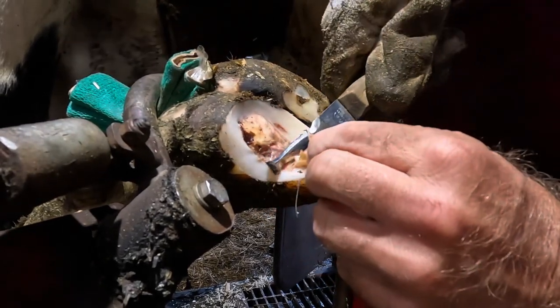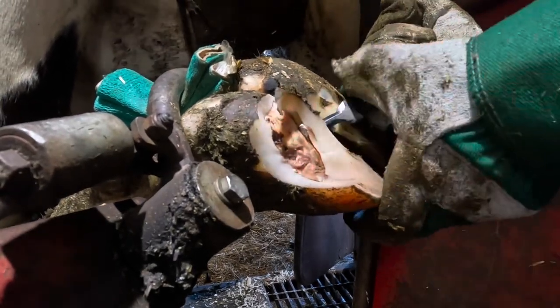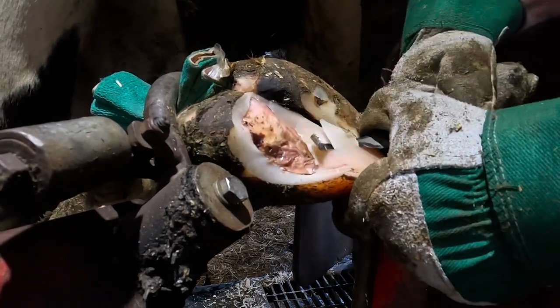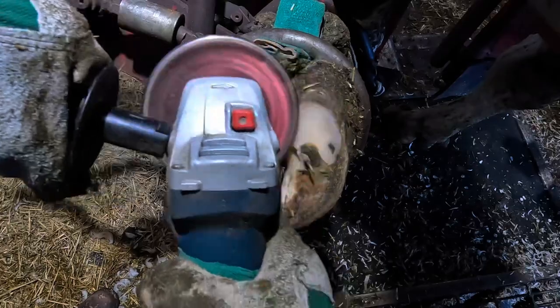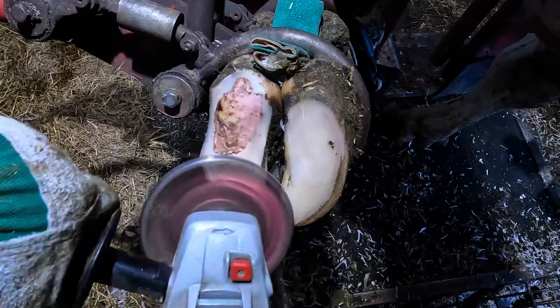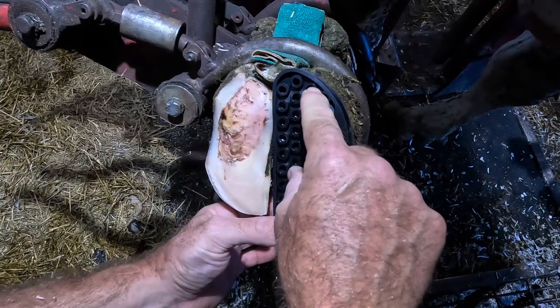Another question you may have: is it really necessary to remove all of this hoof material to get this foot to heal? The answer is yes. We need to get all of the damaged horn from around that lesion away, so that it doesn't trap bacteria, but also because if we leave it there it's going to cause undue pressures around that area — maybe on the edges of that loose horn — and can actually further create a problem or a defect in that white line. Right around that lesion site, we need to get all of that loose horn removed so that the defect doesn't continue over time.